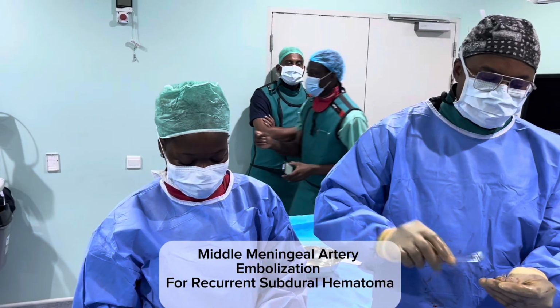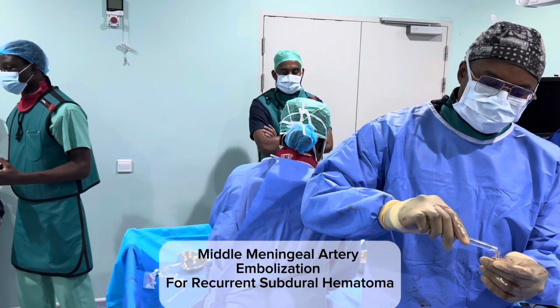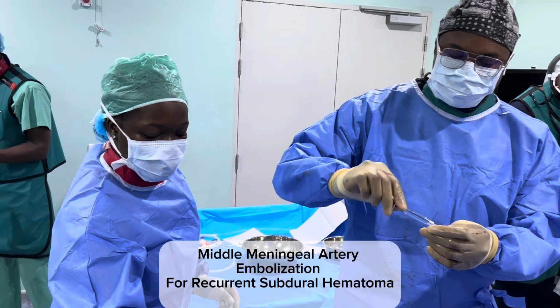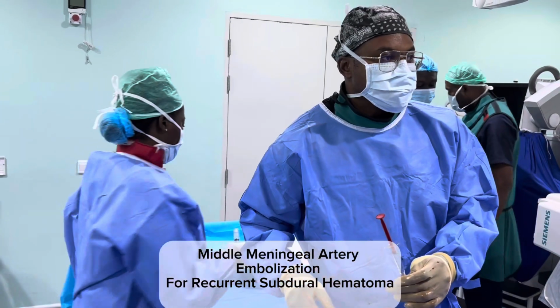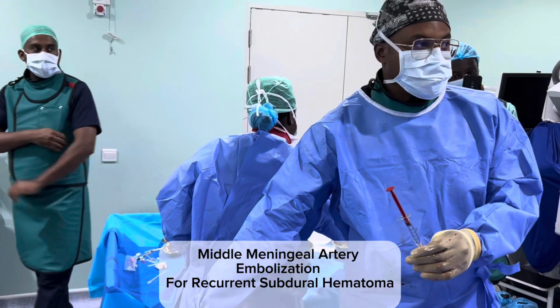So our next case today is embolization of a middle meningeal artery branch. So we perform middle meningeal artery embolizations in patients who have a subdural hematoma and have had chronic subdural bleeds, and they've been to the OR at least once or twice for evacuation of these hematomas. However, they continue to have recurrence of the hematoma.